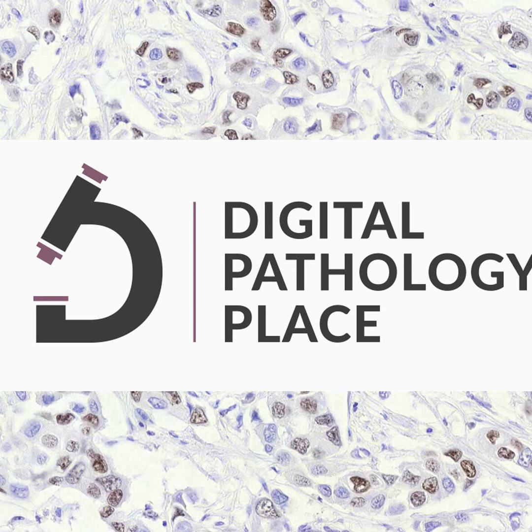There are tasks where you actually want a detailed segmentation, so that you cannot do with these types of weakly supervised approaches. The attention maps are sort of a surrogate segmentation, but generally not accurate enough to be a real segmentation. So there are still many tasks for which we need to do annotations, but I think for classification, we're getting quite close to not needing them anymore.